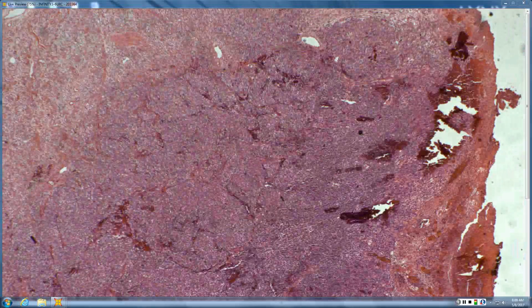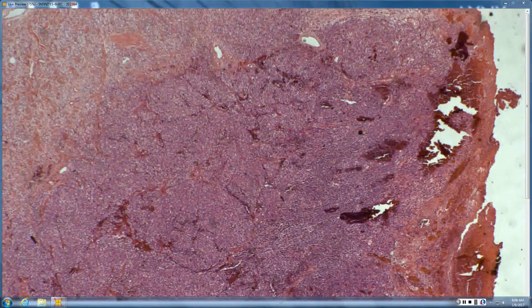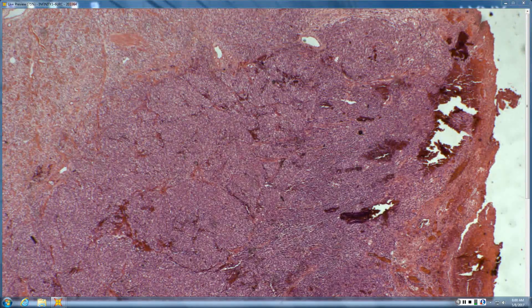You might want to put a muscle marker. What else if it's a big ugly spindle cell neoplasm? Kaposi sarcoma, given the vascularity. But the vascularity could just be secondary, like tumor vessels. So what other things are big, ugly spindle cell tumors smacked up against the epidermis or eroding the epidermis? Leiomyosarcoma. Yeah, so leiomyosarcoma, AFX, spindled squamous cell carcinoma, melanoma, and this one proved to be melanoma. Just big, ugly, spindled melanoma. But again, you were thinking your way through it very well.